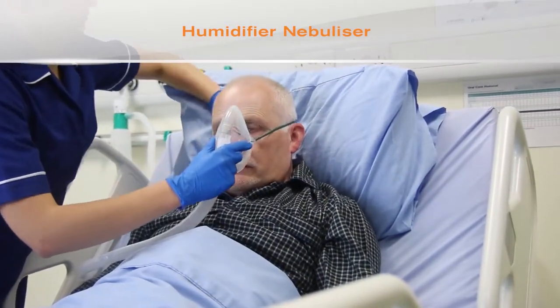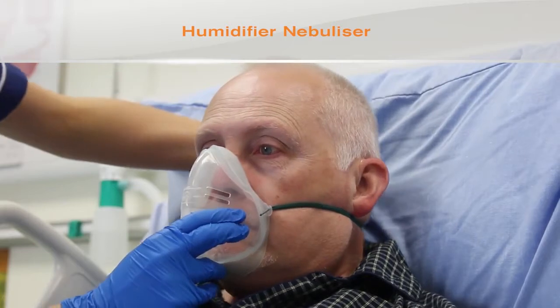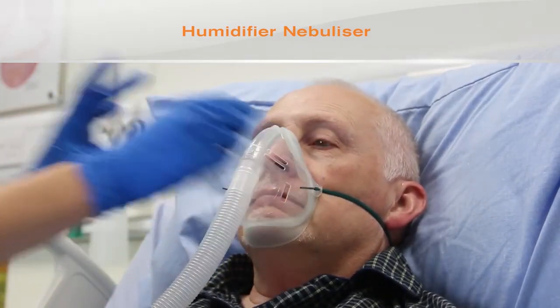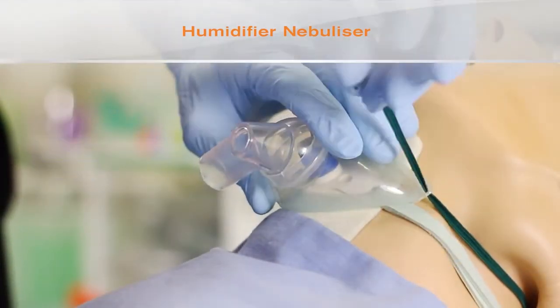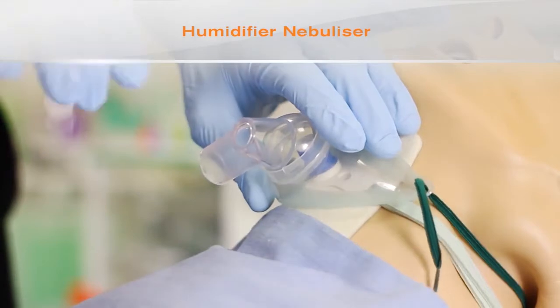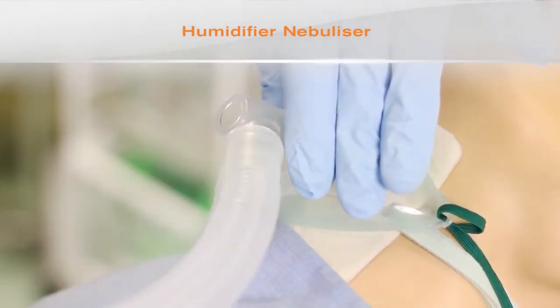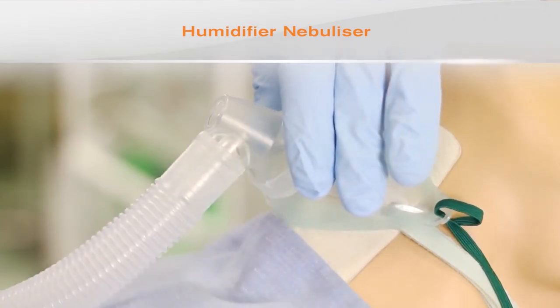An aerosol mask should be placed over the patient's nose and mouth, and the elastic is adjusted to give a secure and comfortable fit. When using a tracheostomy mask, the mask is positioned over the patient's tracheostomy site and secured in place using an adjustable elastic strap around the patient's neck.